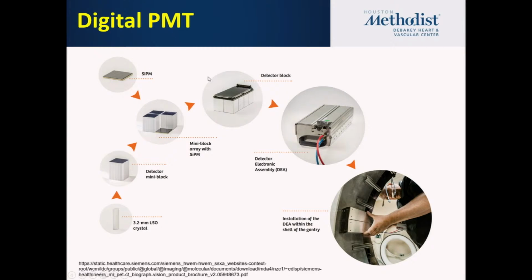It's called the SiPM, and this one will allow you now as a whole unit to have much higher sensitivity, and now you're able to amplify the signal you get from lower doses of rubidium. And technically, you're not even saturating in these patients unless you reach really very high doses of injection.